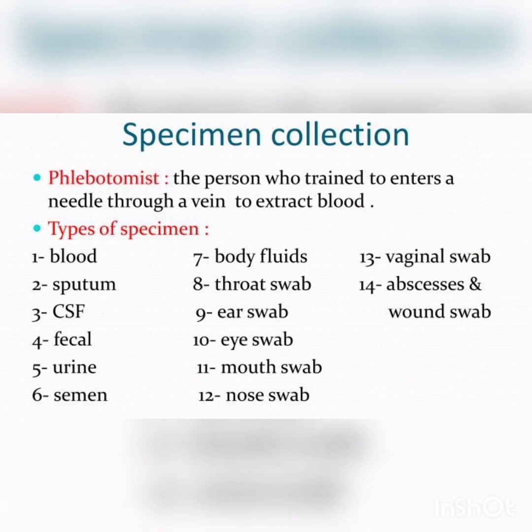So for anaerobic culture, double stoppered collection tubes are used. They are gassed out with oxygen-free carbon dioxide or nitrogen. So inside that tube there will be nil oxygen, because anaerobic organisms cannot survive in the presence of oxygen.